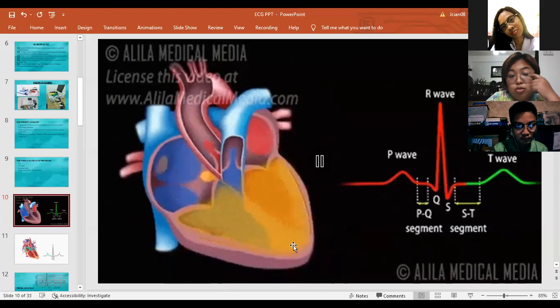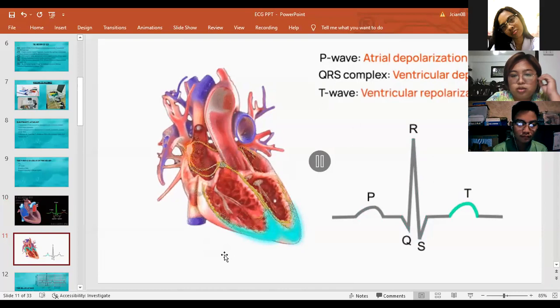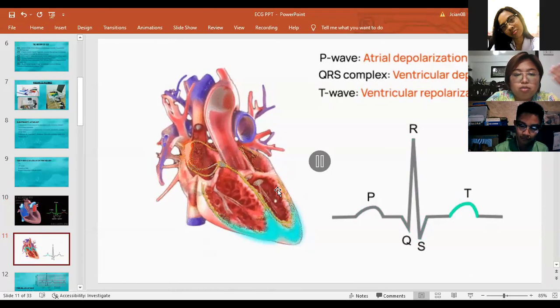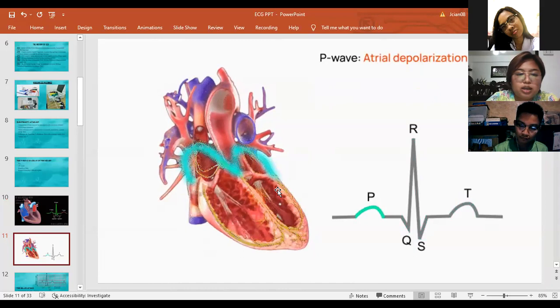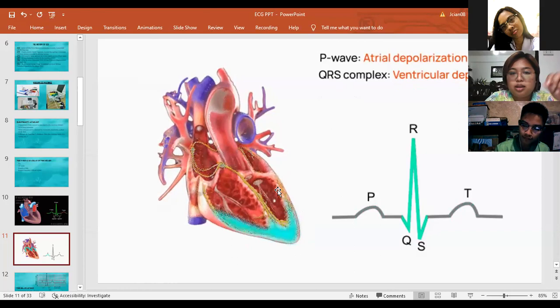Diba medyo naglalag si picture? Binibigyan ko lang kayo ng preview tungkol sa heart. Kung paano nga ba ang tawag dyan. Yung mga anatomy, physiology, and yung mga parts, yun lang naman yung mga mahalaga pagdating sa ECG. Ang mahalaga naman dyan is yung how to perform it, mga bunso. Kasi madami talaga nalilito kung saan ikakabit yung V1, ganyan-ganyan. Yun yung pinaka highlight po ng ating lecture.